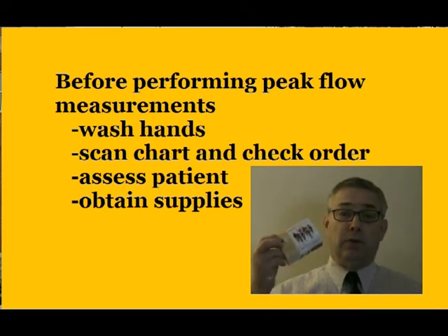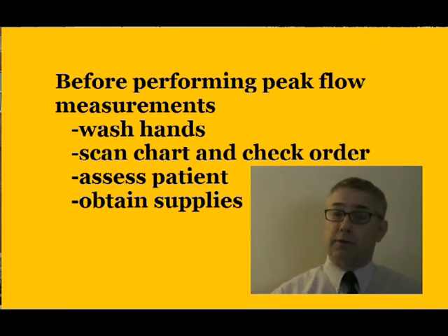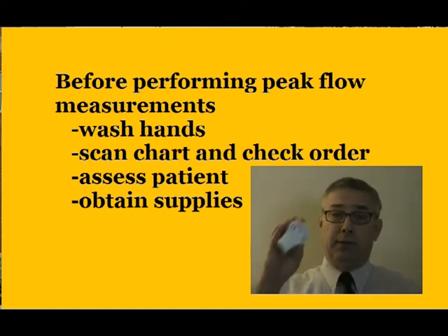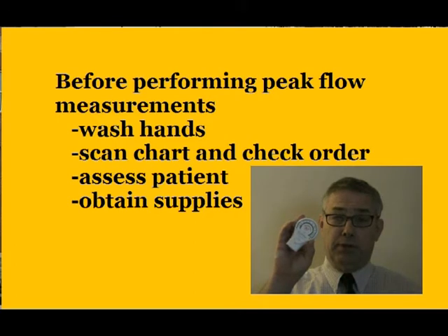In this video, we will be using this spirometer by Spirometrics. There are many other types of spirometers, but you'll need to learn those specifically. This is the spirometer we'll be using.